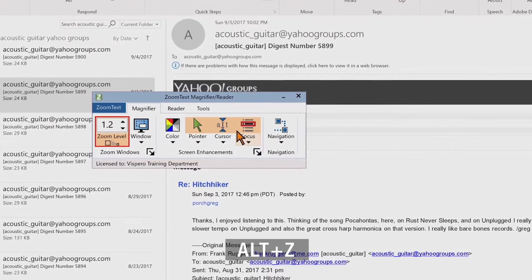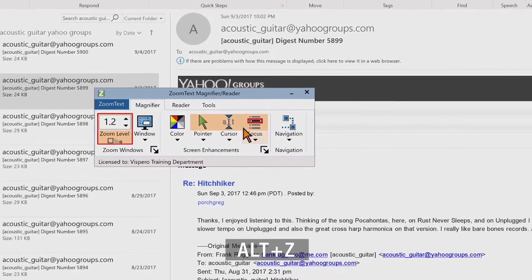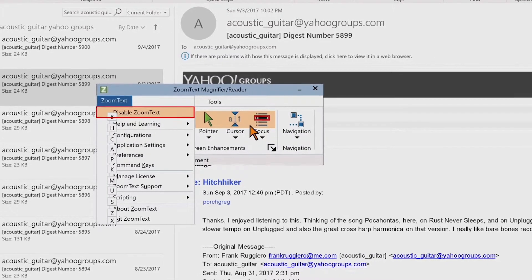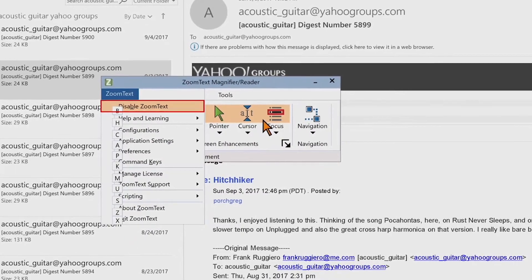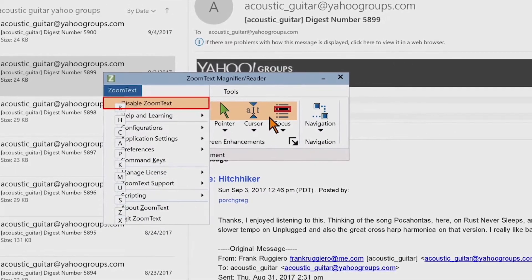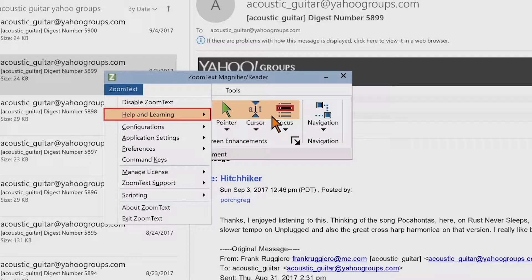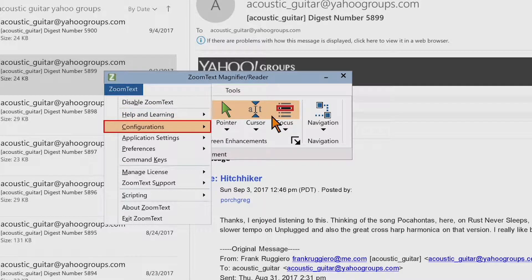Pressing Alt-Z opens the ZoomText menu. Here you find where you can toggle ZoomText on and off, open ZoomText help, save and load configurations, configure the command keys, use support tools and more. Press Escape to close the menu.